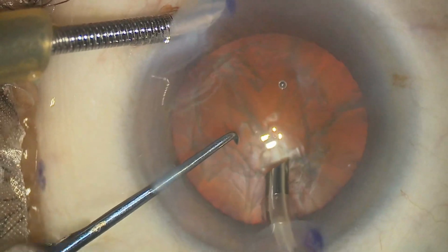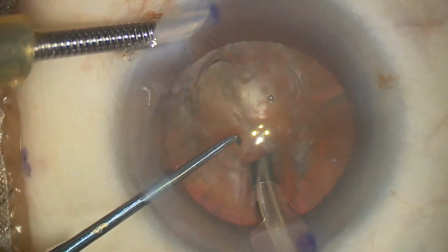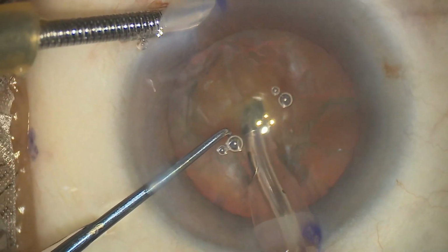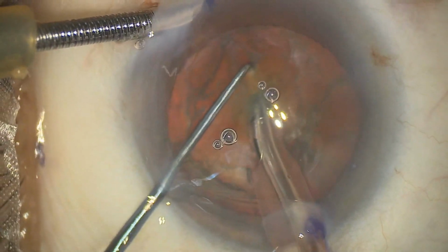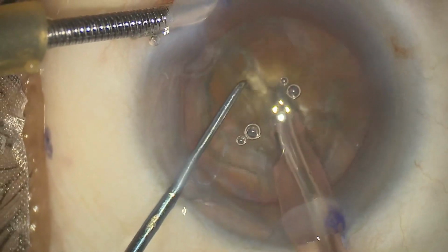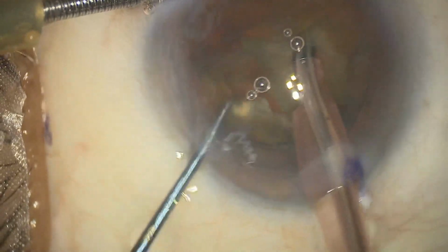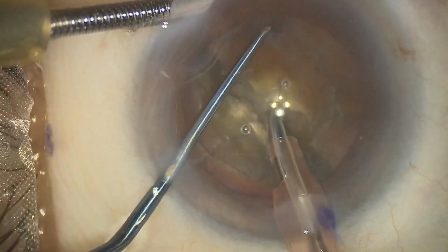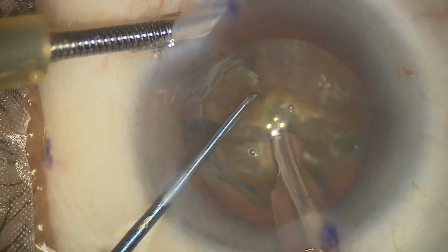This is one more case of a hard cataract, a black cataract. I choose horizontal chop in this case. I bury the phaco tip at a stiff angle. I engage the chopper just in front of the phaco tip and bring the chopper toward the phaco tip and create a crack and lateral separation. Both actions are done in a mechanical way. There is no use of phaco energy. I use phaco energy only to engage the phaco tip.